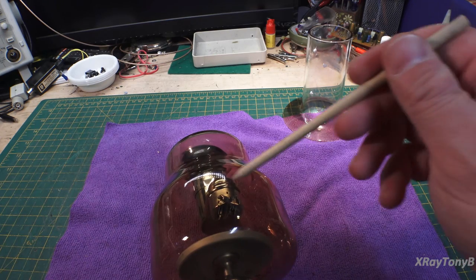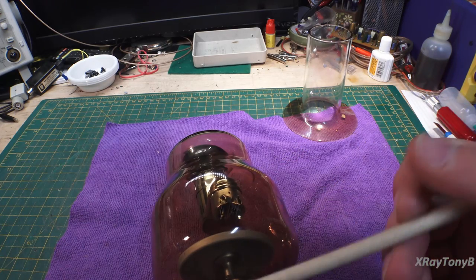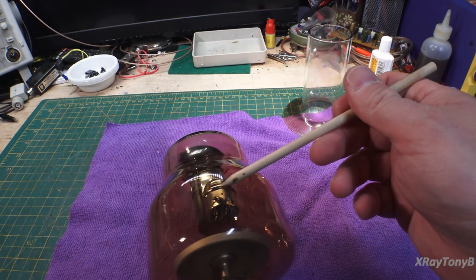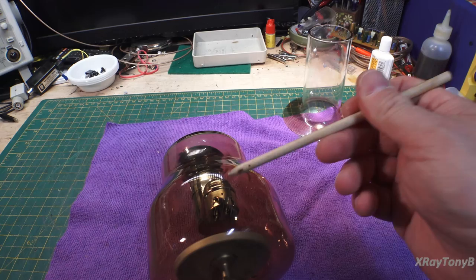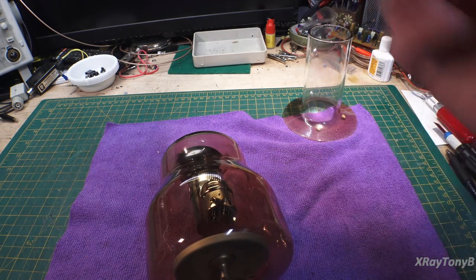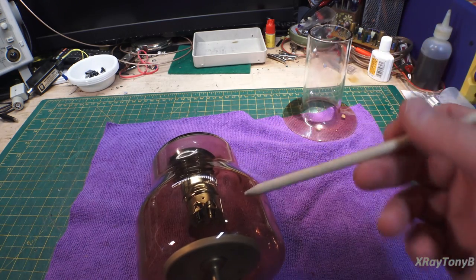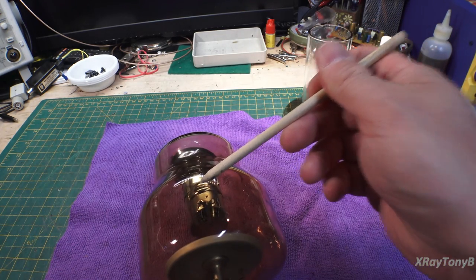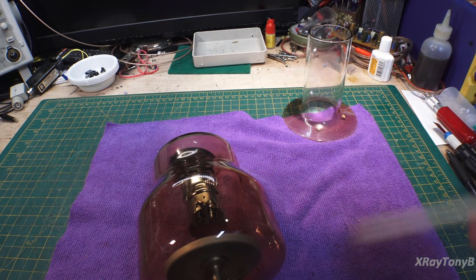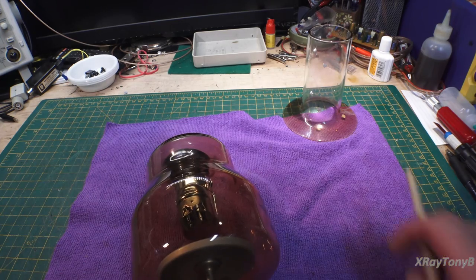Now, the current flowing through the filament is not to be confused with mA. mA is the current flowing from the cathode to the anode, not the current flowing through the filament. So this we refer to as filament current, and the current flowing from the cathode to the anode we refer to as tube current. Again, I'm going to get into that more in part two.